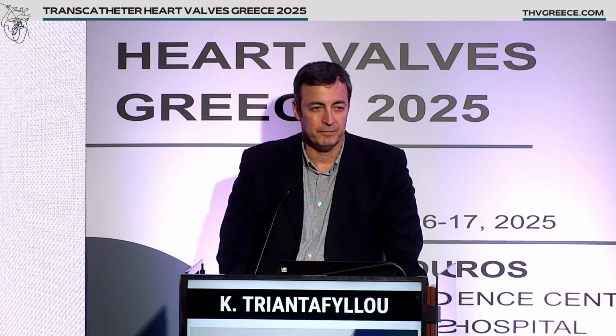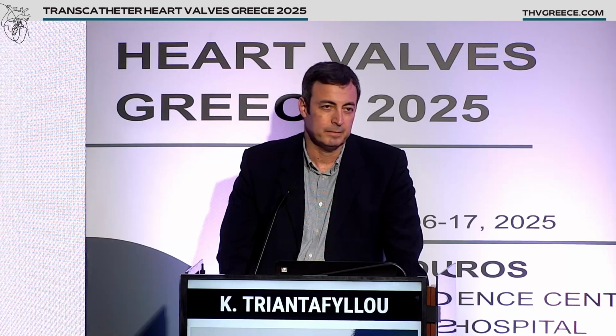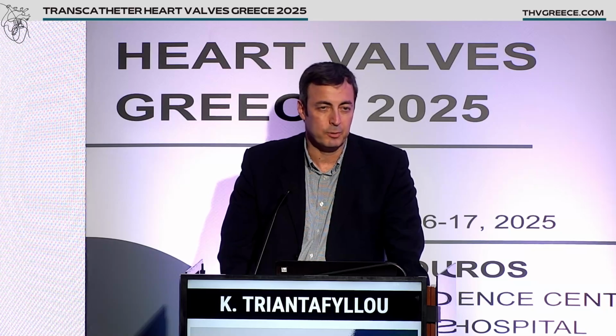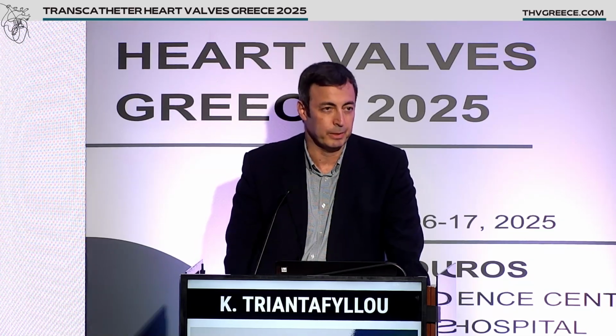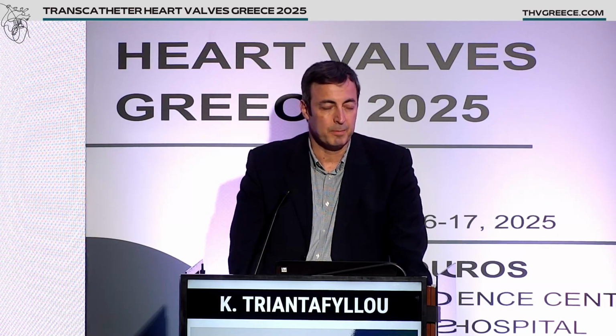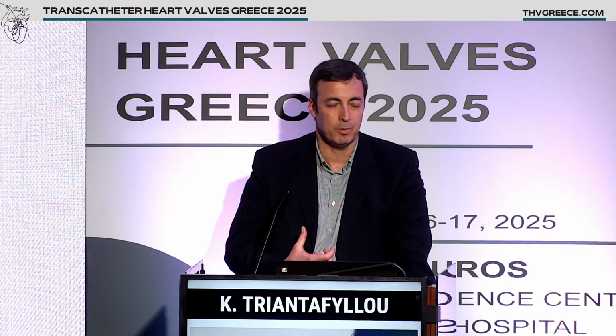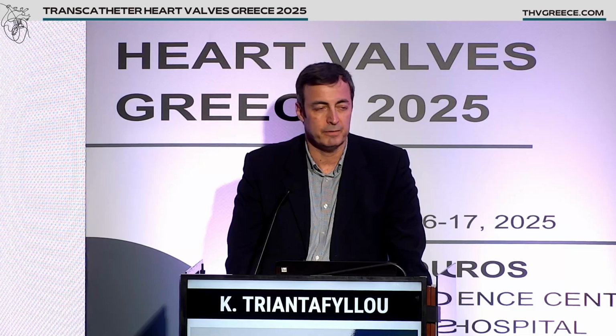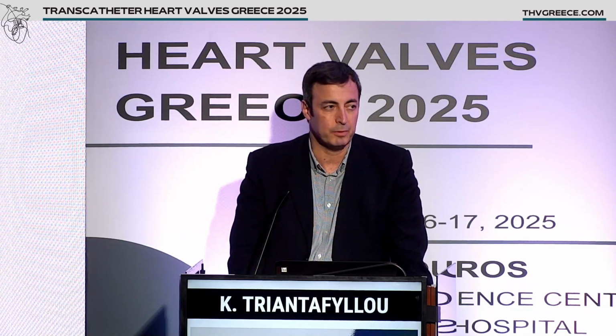In the case of a valve with a dysfunctional, like here, dysfunctional Trifecta, what are your calls about that? You know that if you will use this procedure. It's a very difficult valve, which is out of the market at the moment because of a failure history. We have to take care of the implantation height of the new valve. It's better to select a supraannular self-expanding valve, such as the one that we used, in order to have a better hemodynamic result. We have to think about creating some space by post-dilating mostly in order to remodel the Trifecta and create more space for the function of the new valve. And since these cases very often have small anatomies, we have to take care of the coronaries.